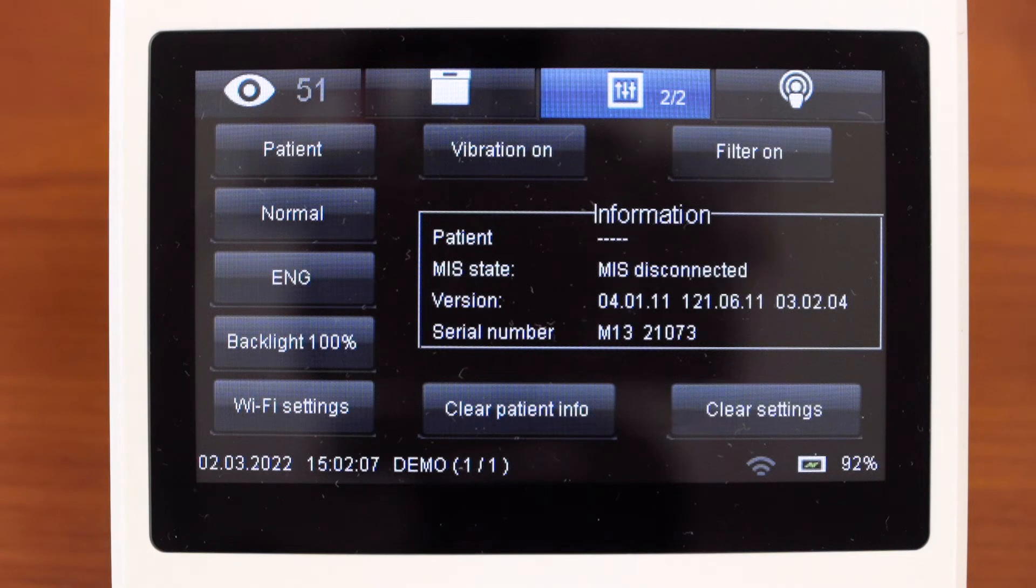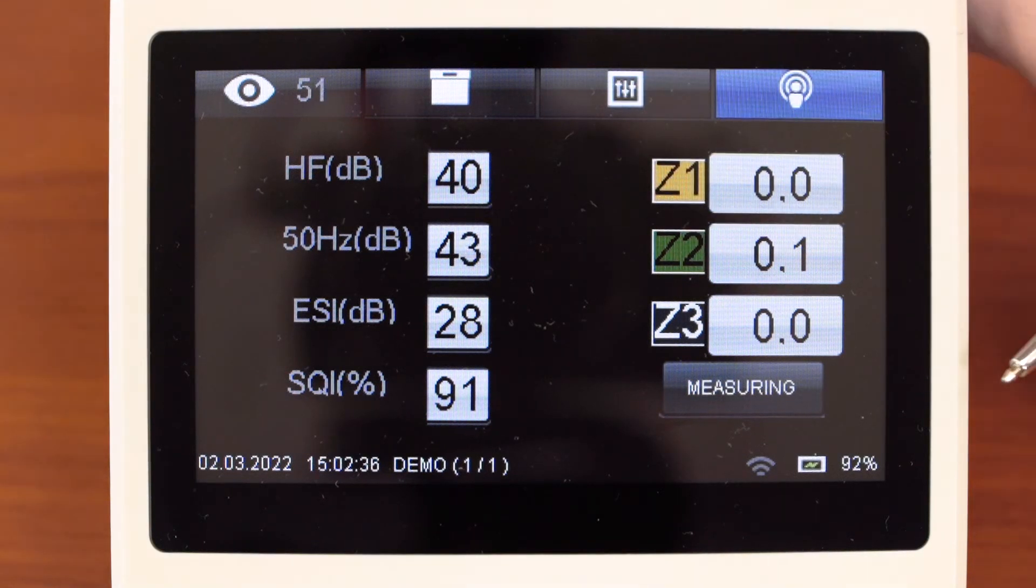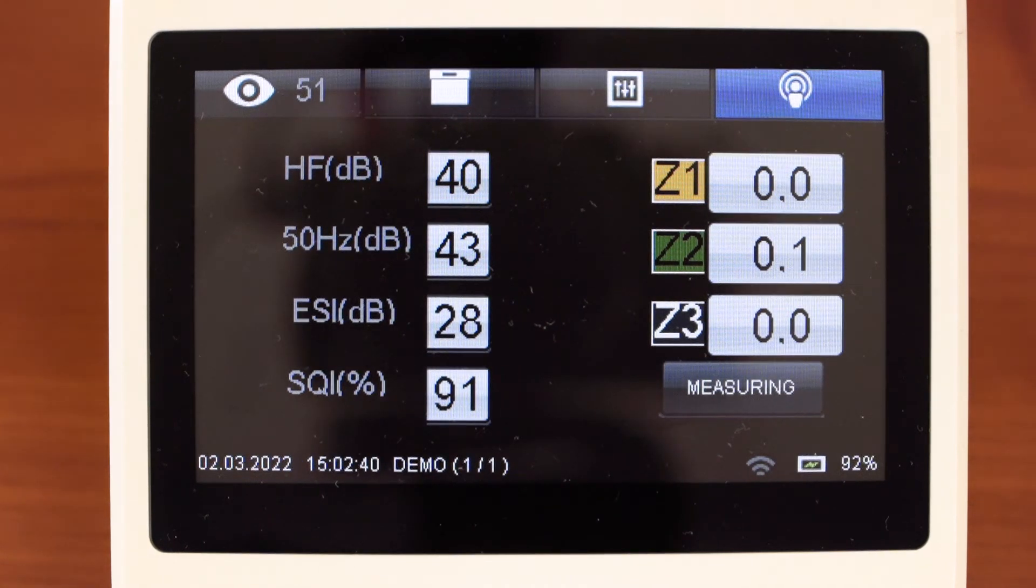The last window is signal quality. We can estimate the quality of electrode application. Different color corresponds to electrodes: yellow, green and black. Electrode impedance is displayed. This is a button measurement. Press it to make manual measurement or update the digital values.